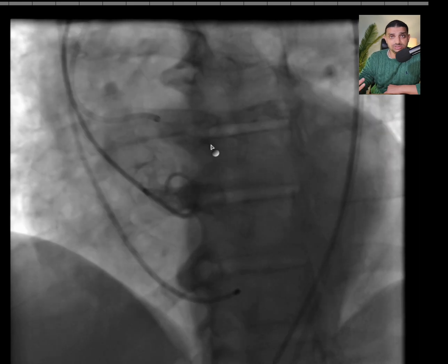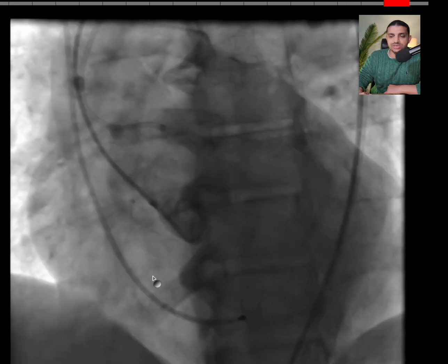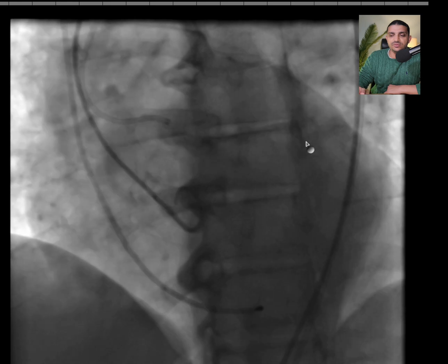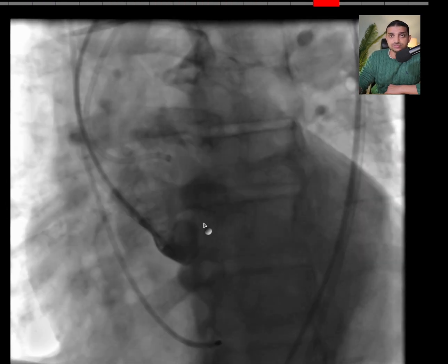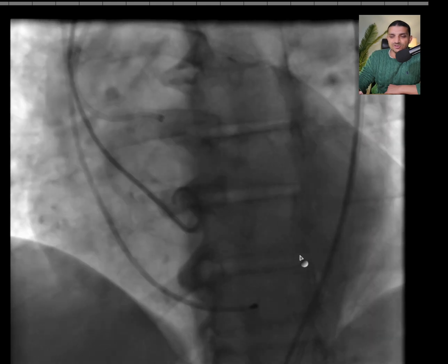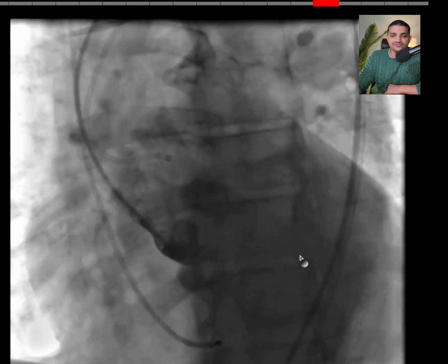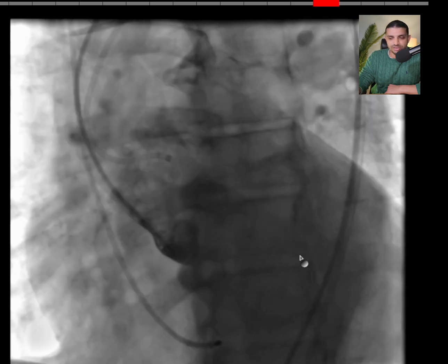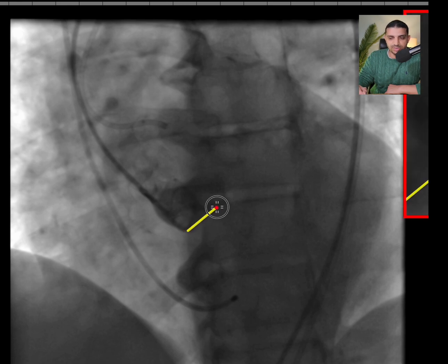We start the C, which is the crossing. The most important thing here is that you have to make the coplanar view and adjust it. As you remember from the previous videos, in order to do so you have to first get the angulation from the CT and then make fine adjustments using the 'follow the right cusp' rule. Here I'm just making sure that the three cusps are aligned on the same line.